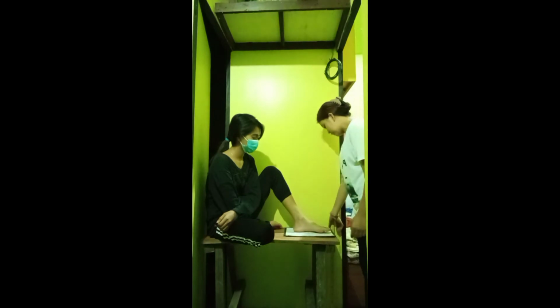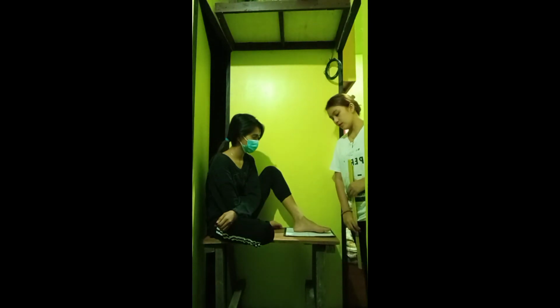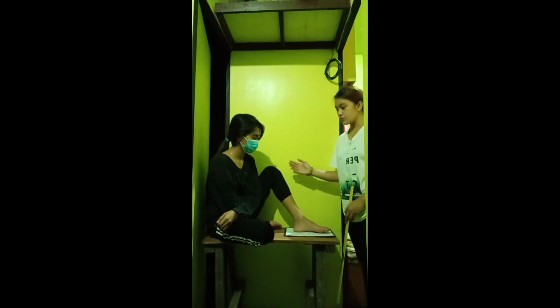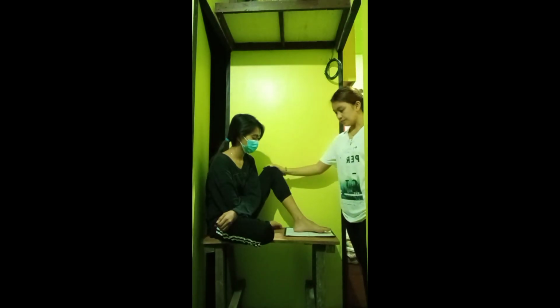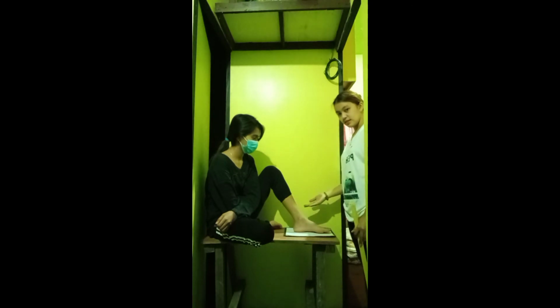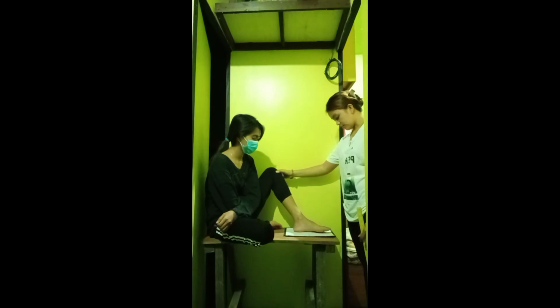The central ray is perpendicularly directed entering the base of the patient's metatarsal. In the AP oblique lateral projection, the foot of the patient is rotated 30 degrees externally, or outward. 30 degrees.